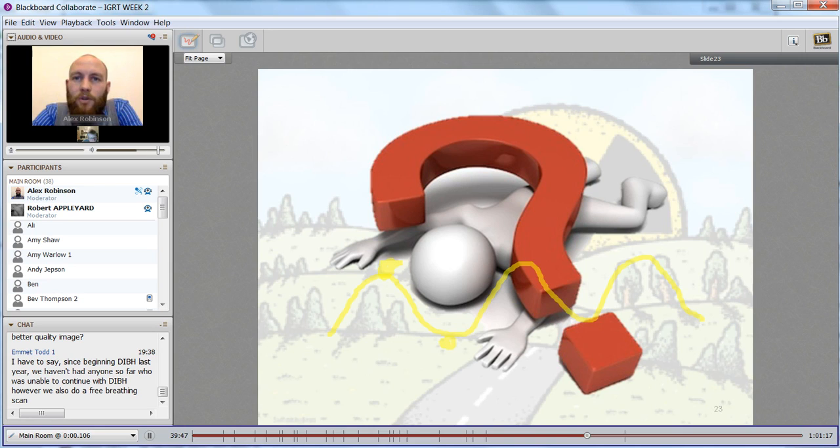But before we let the patient off the bed, we have to make sure that we've got all the data that's suitable for the planning. So this does mean that the time from the end of the scan to where we get them off the bed is increased.